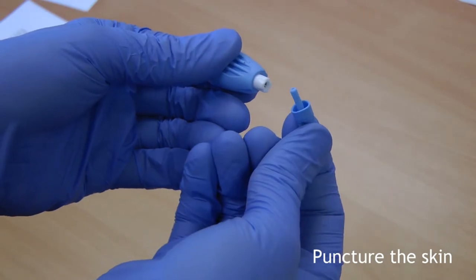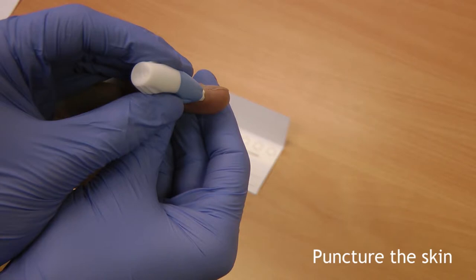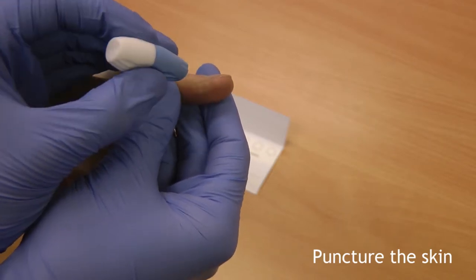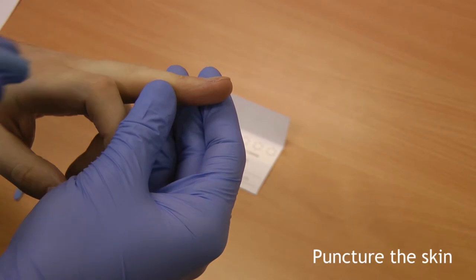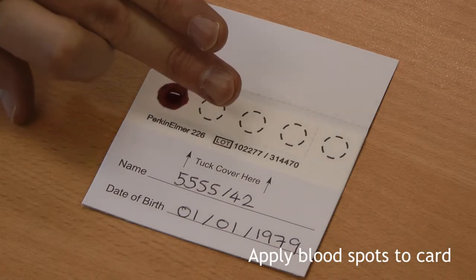Holding the lancet between your index finger and thumb, place the tip of the lancet on the finger you have cleaned with the alcohol wipe. Gently apply pressure until the lancet is activated. A clicking sound will be heard when this has happened. The finger should now bleed.